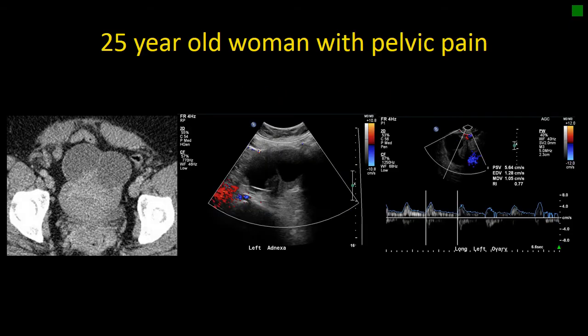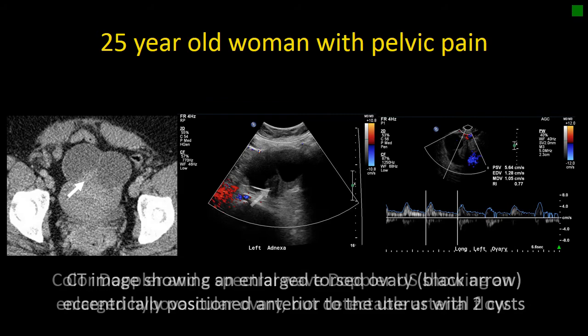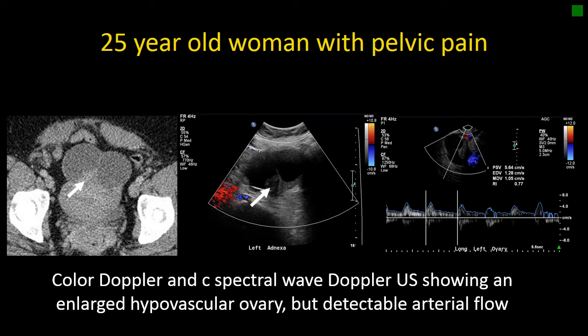Now let's take a look at a case of a 25-year-old woman presenting with pelvic pain. She received a CT in the emergency room, and on CT we saw an ovary positioned anterior to the uterus with two large cysts. The white arrow points to the ovarian stroma, which is thicker than you would expect. Also note slight uterine deviation. Because of the suspicious location of the ovary, an ultrasound was performed, which showed a somewhat hypovascular ovary — meaning not good blood flow is detectable within that triangular area of soft tissue between the two cysts.